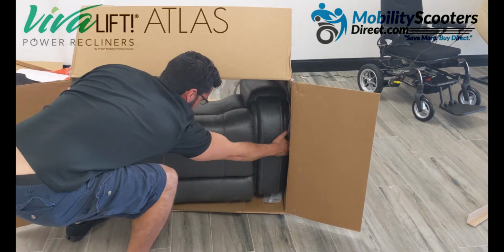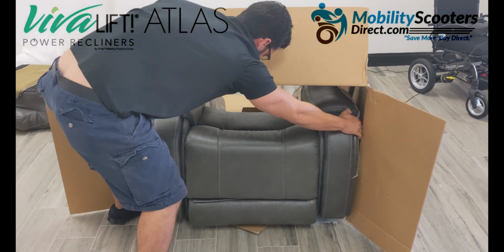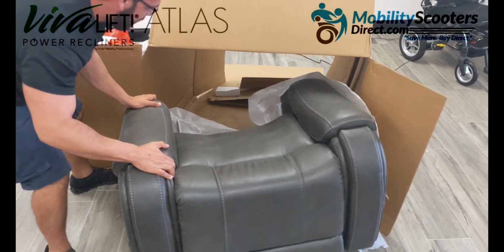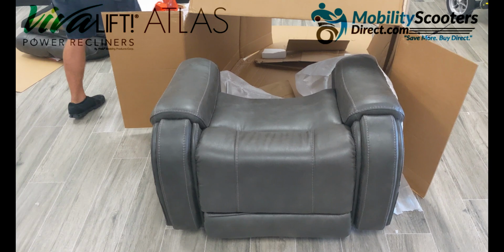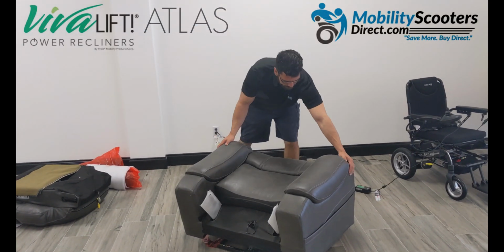It does take a little bit of effort if you only have one person to help you, but the important thing is just to get the chair out of the box while preventing as much damage to the box as possible. Now that we have the chair out of the box, we're going to make a little room and show you how to assemble the chair.